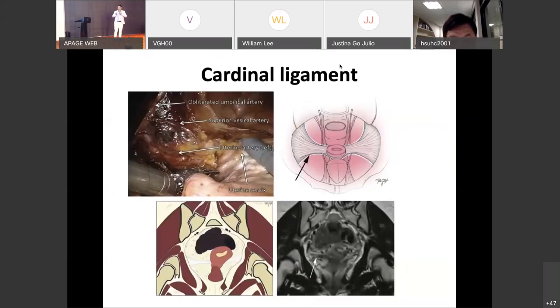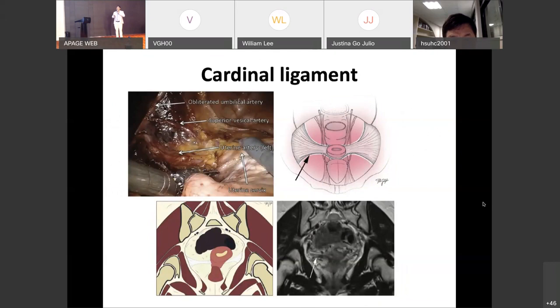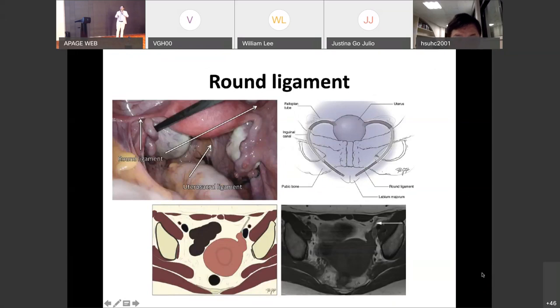The second structure is the cardinal ligament. The cardinal ligament is the main supporting ligament for the entire uterine structure. The best imaging to identify it is the coronal T2-weighted view, where you can see the dark band supporting the uterus from the bilateral sides of the pelvis.